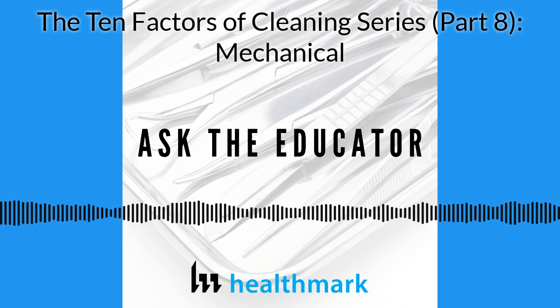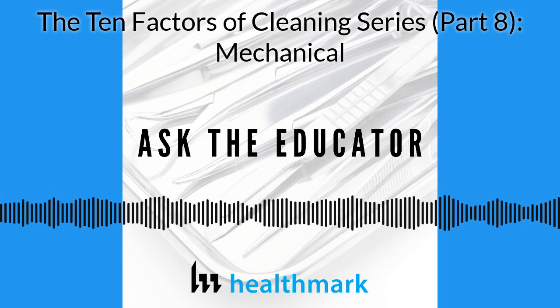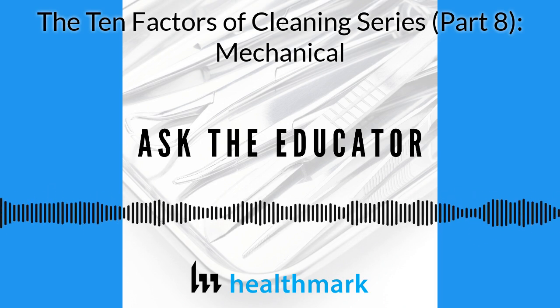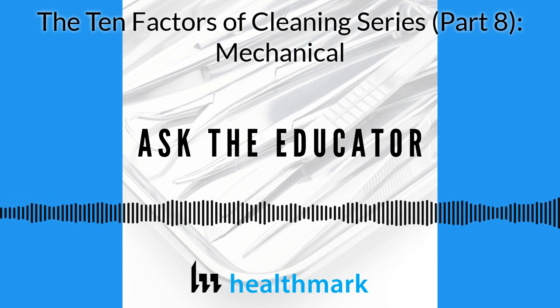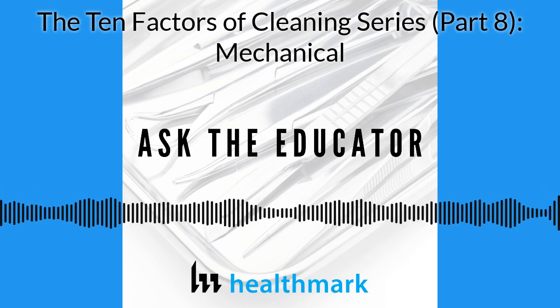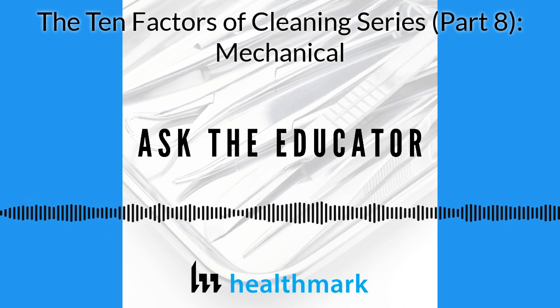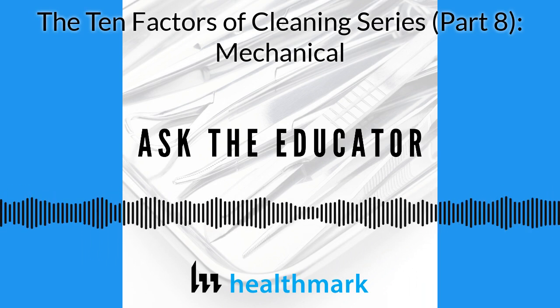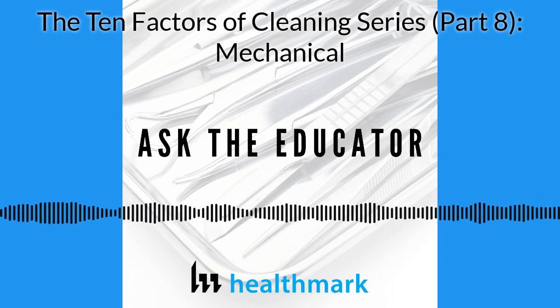Yeah, I think that's good. And I like that you mentioned all those different things that can go wrong. I remember looking in and seeing the water just didn't look right in the window, and then it finally finished its cycle, and you'd realize there was an instrument blocking the arm from spinning, so now we've got to do it again. There are all those different things that can stop your automated equipment from working appropriately and getting that mechanical action we're talking about. Yeah.